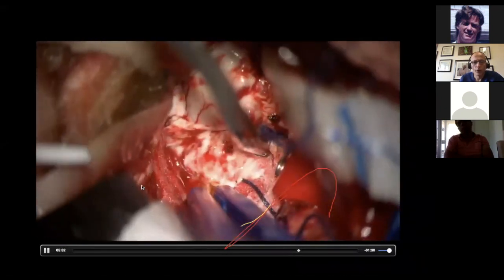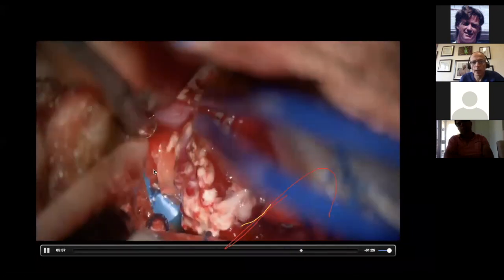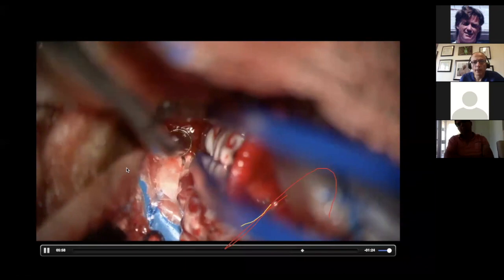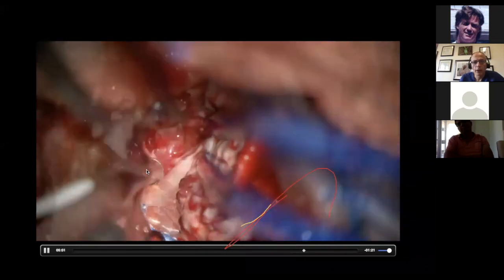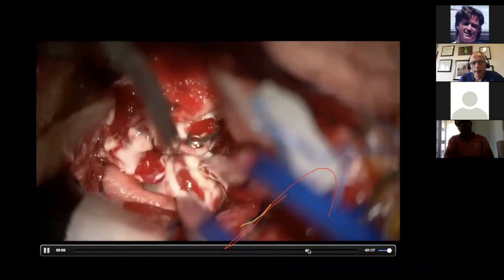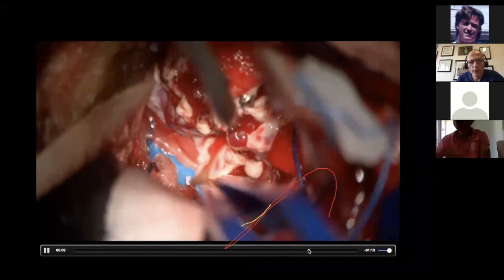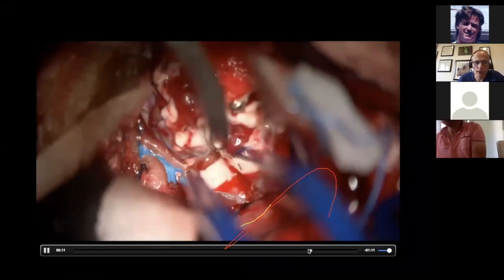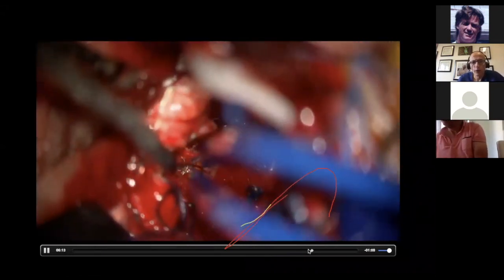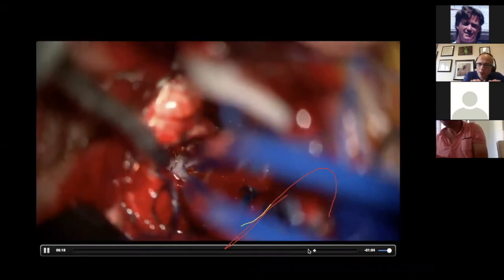So I had to use the retractor, which I don't like using normally, but this is a deep area and I well padded the cortex. Again, don't be dogmatic. Instead of damaging with constant retraction with your bipolar, just put the retraction, just hold the brain. Like Takanori Fukushima tells you, I'm holding the brain. That's what he says.